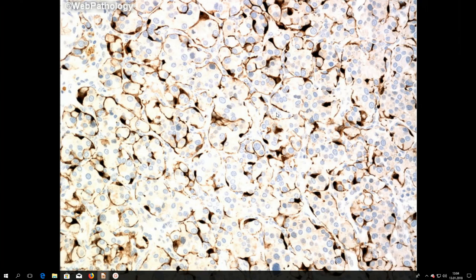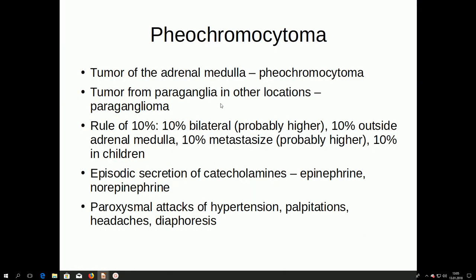This is S100 immunohistochemistry showing positive sustentacular cells — this image is from web pathology. Pheochromocytoma is a tumor of the adrenal medulla, and a very similar tumor in other locations is called a paraganglioma.